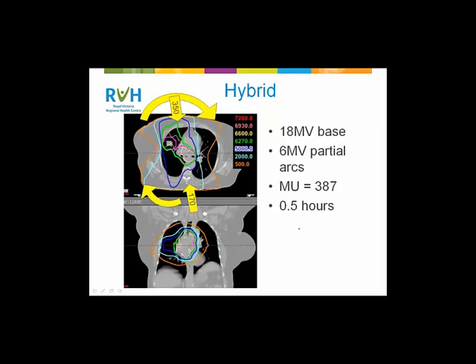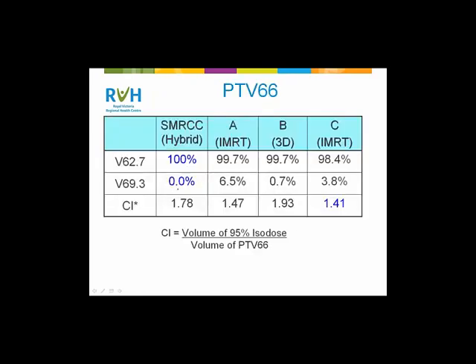So for some of the options, the angles used by the other centers, for the most part, fell within the partial arc of the hybrid rapid arc. And this was very reassuring for us because this was how we intended the arc to be used, to define a range of angles and let the computer optimize how dose was pushed through those beam angles.